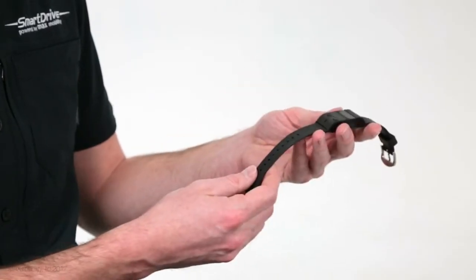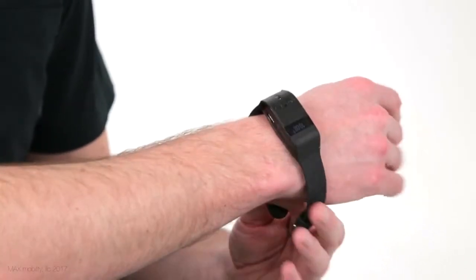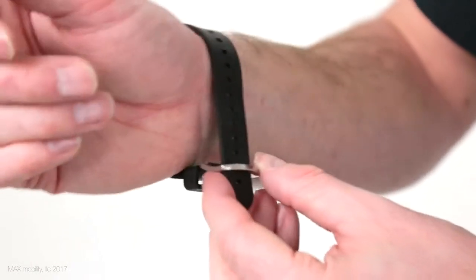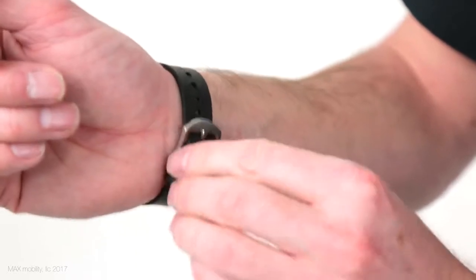The PushTracker has 3 interchangeable size straps, all made from TPE, a latex-free material that is completely biocompatible. A majority of people will use the medium, but refer to the chart in the PushTracker user's manual for the one that's best for your wrist circumference.